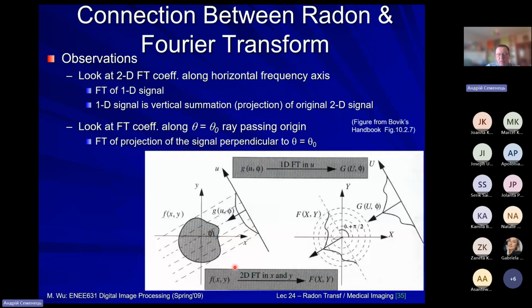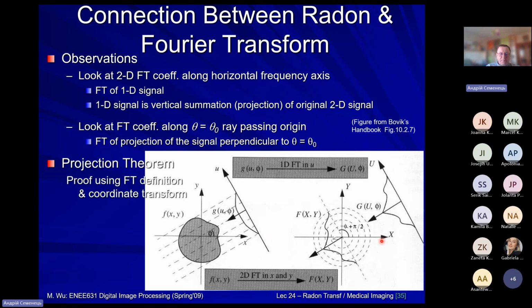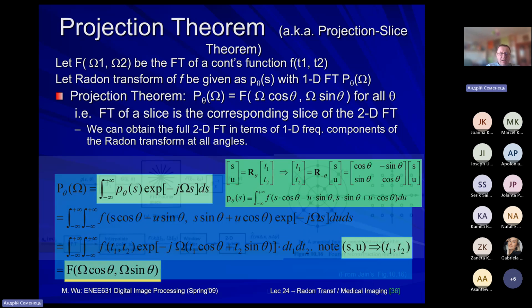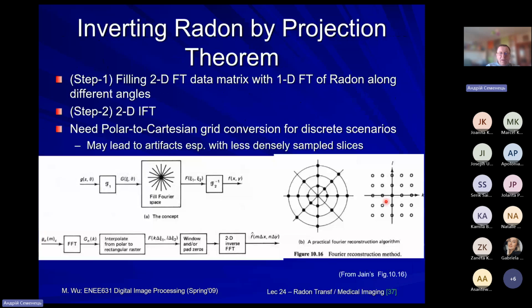And so with the inverted transformation, we will receive a function which will represent for us the original image. And actually it will be this one. So here is this integral that has to be solved in order to rebuild our image.